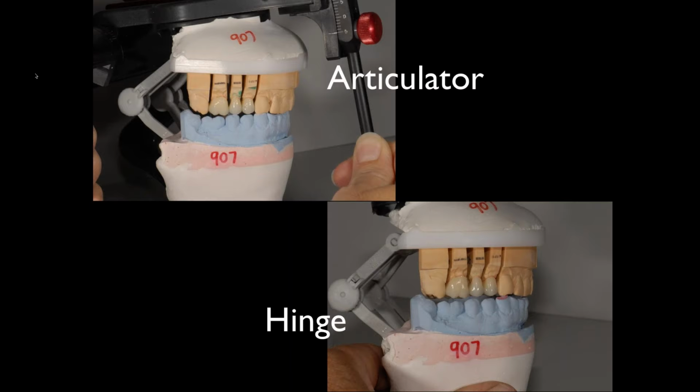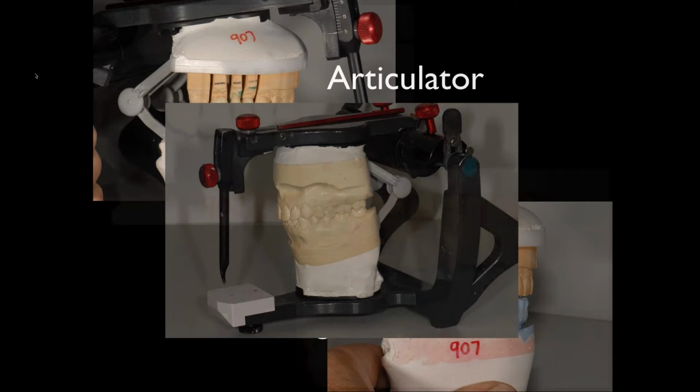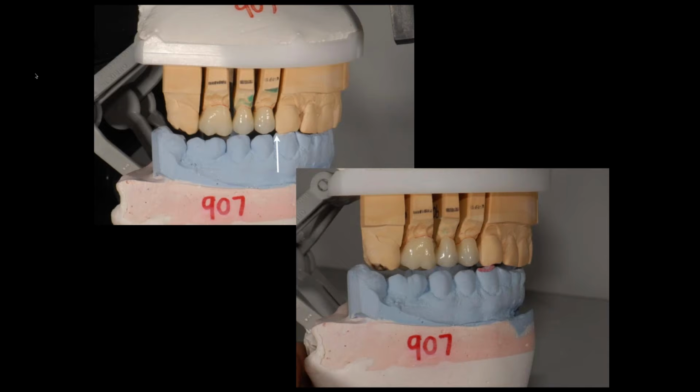On the articulator, on the hinge, take a look at this, okay? And again, I use this double mounting to do this. But look here, look where these two cuspids are. When we're in lateral, the distals are almost end to end. Look where they are here. They're in a completely different position.